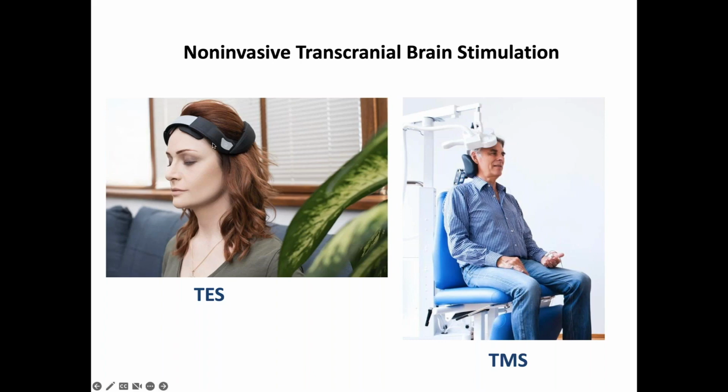And here you place a couple of electrodes, at least 2 electrodes, on the outside of the scalp of your subject or patient, and a very low intensity current, a couple of milliampere, flows from the anode to the cathode, and thereby you can also stimulate the underlying neural tissue. The neurophysiological mechanisms are slightly different compared to TMS, but I don't have the time to go into the details. It also doesn't matter that much.